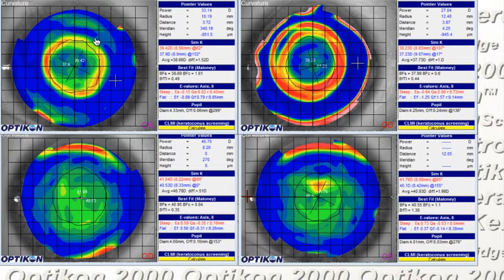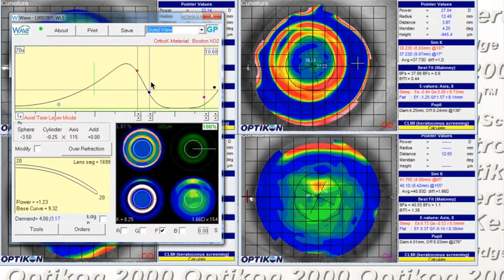Now the patient's main complaint is glare in low light situations, and there's some blur in the left eye. Here we see the lens that the patient is wearing for the left eye. There's about a diopter and a half of with-the-rule astigmatism, mostly contained within the pupil.